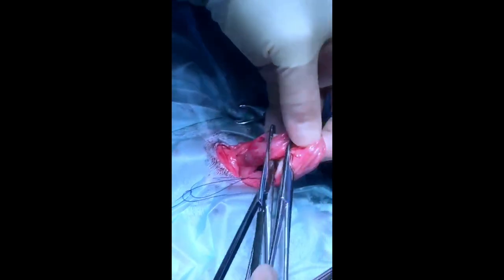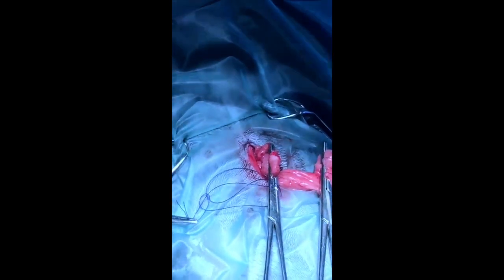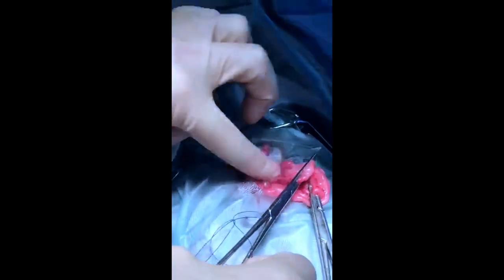I'll then cut the uterus between the two pairs of forceps. Even if this most proximal set of forceps were to come off with a little hemorrhage, there's no tension on the pedicle so the forceps can easily be reapplied, and then the varying pedicles down here.